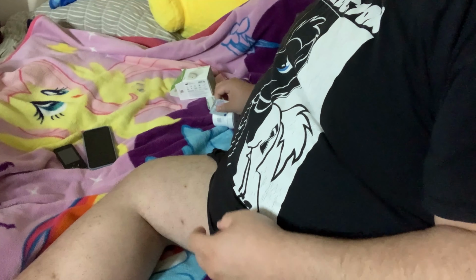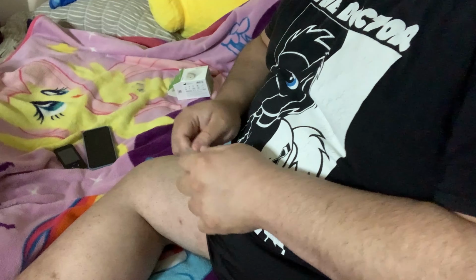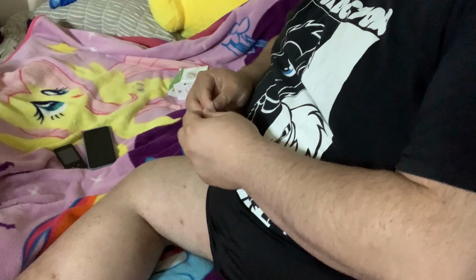All right, so simple. You guys already see me take out everything. That, of course. Now it's time. Even though I cleaned my skin already, I do have to be prepared. And it doesn't matter if the Dexcom logo shows in both directions, as long as it reads really well. Make sure that area is nice and clean.